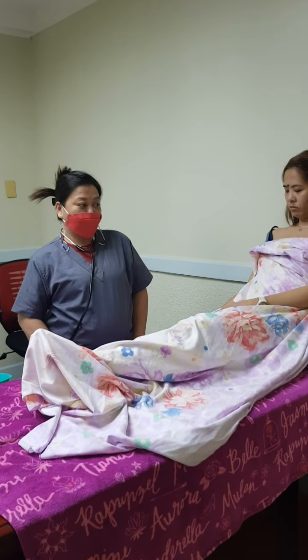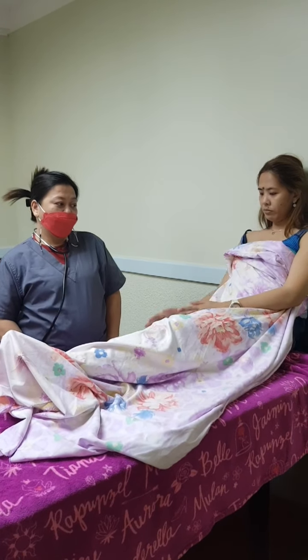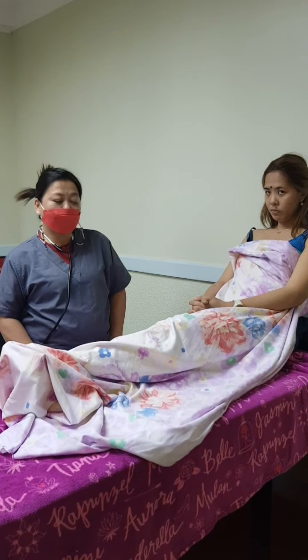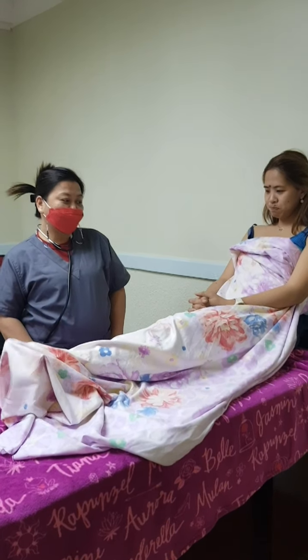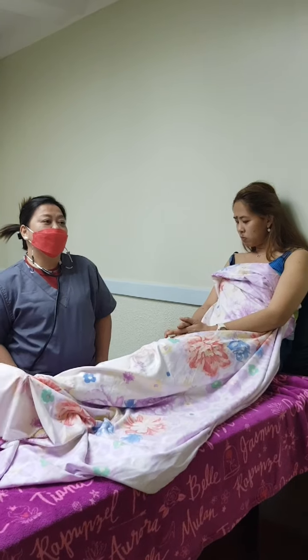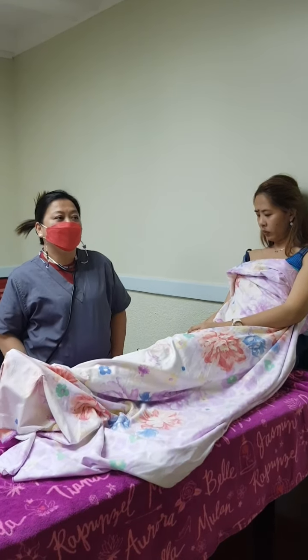The purpose of this is to feed the client with fluids when oral intake is not possible, to dilute and remove ingested poison, to instill ice-cold solution to control gastric bleeding, to prevent stress on an operated site by decompressing stomach secretions and gas, and to relieve vomiting and distension.